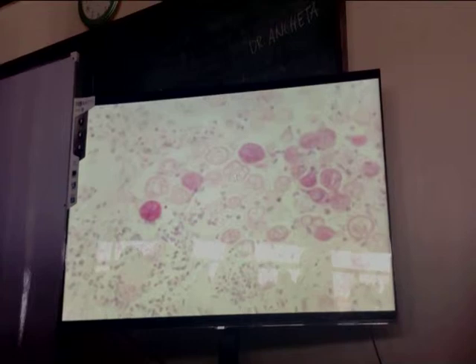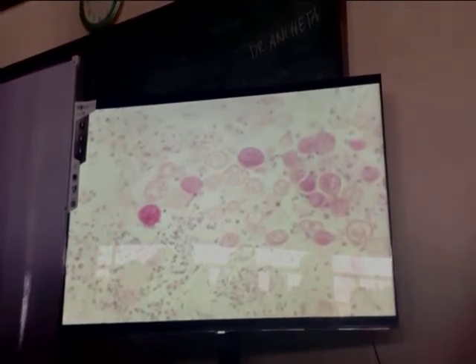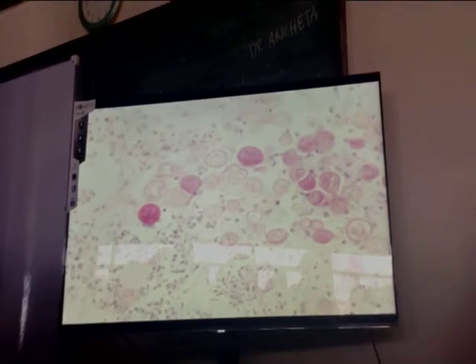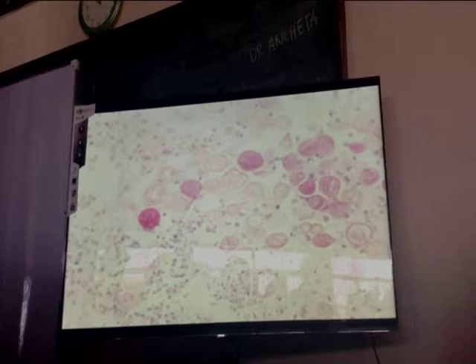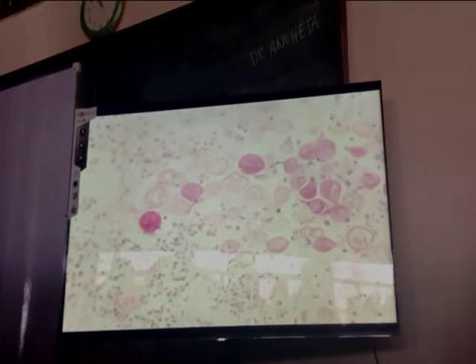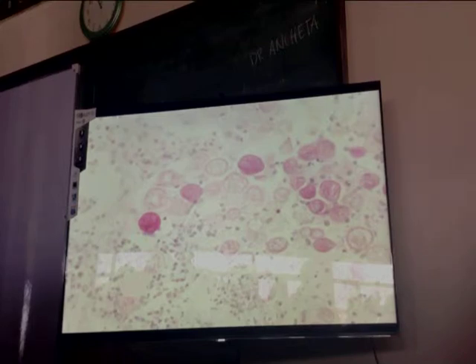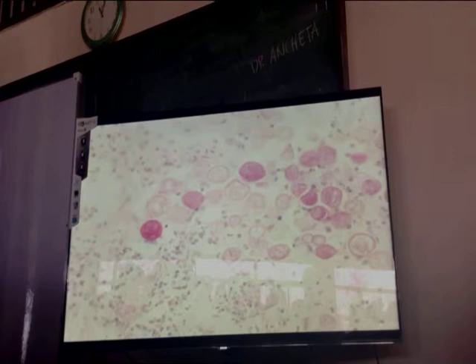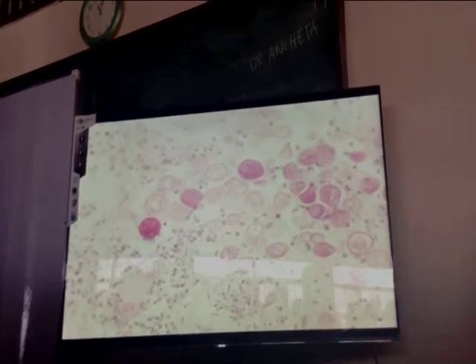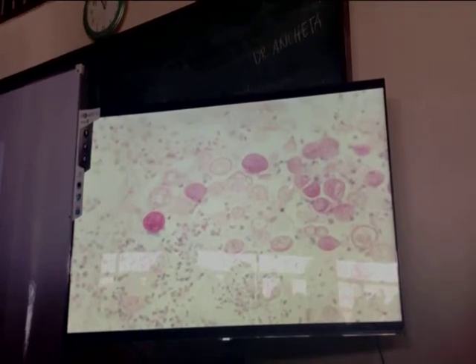Okay, so they are not normal components of the lungs. That is why we are able to see lymphocytes and macrophages surrounding them. Okay, so what is the diagnosis for slide number 133? Coccidioidomycosis. So those are the fungal spores of coccidioidomycosis.